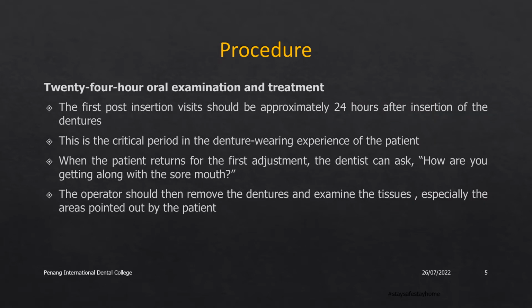So the first recall is usually done 24 to 48 hours after insertion of the complete dentures. This is a critical period for the denture wearer because during this period he has worn the denture and he may have certain specific problems, or you may call it an adjustment phase, that need to be addressed at this time. The operator should remove the dentures and examine the tissues, especially the denture basal seat areas, to see if there are any pressure spots, sore spots, or any ulceration that may need to be taken care of.